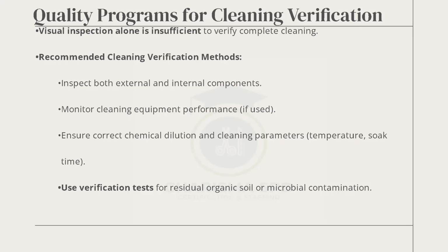So there are commercially produced test strips. You inject a solution through the lumen part of the channel, the opening part of the endoscope, and then you use a cap to collect the solution that you've injected, because the solution is going to flush the channel. If there is any debris in there, meaning that it was not properly cleaned, the test strip will fail. It will give you a color chart. If the strip looks like this, it passed. If it looks like this, it failed.